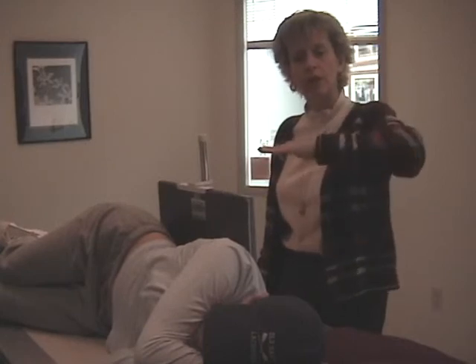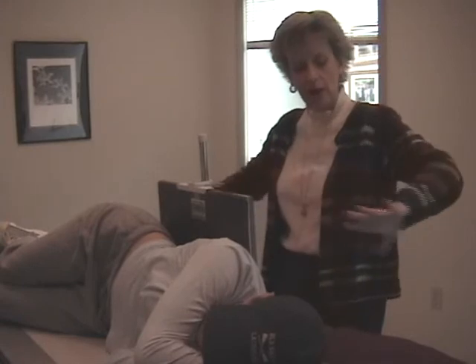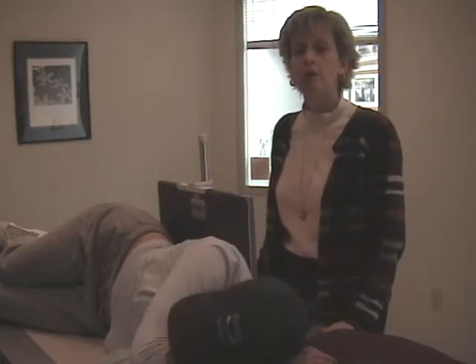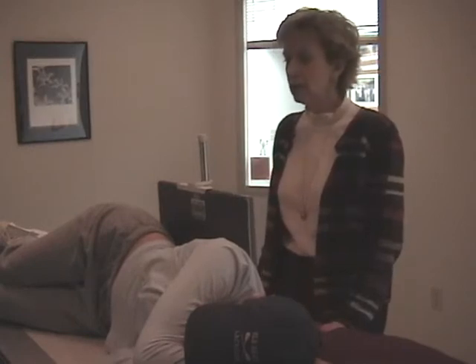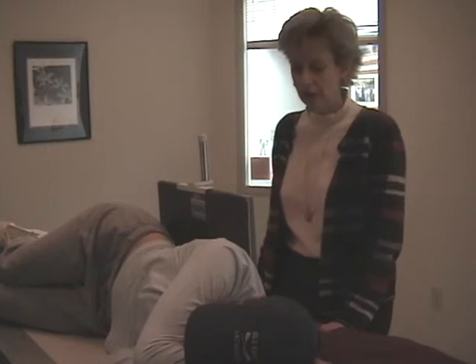But once the patient went into that recumbent mode, the air fluid levels spread out through the body and we would not be able to demonstrate them. So I turned the patient up onto her side the very, very first thing. And by the time I readjusted the room and changed cassettes and set it up like this, it's been about 10 minutes. So let me explain to you what we've done.